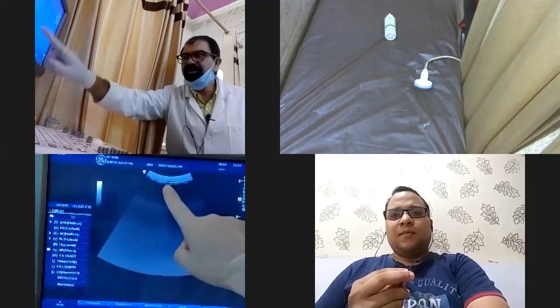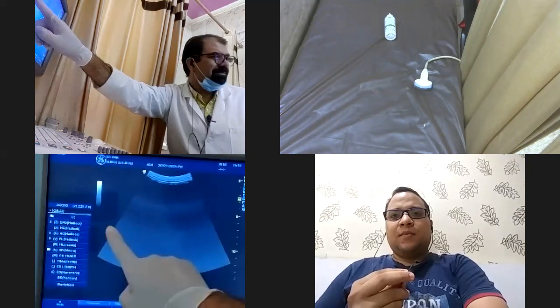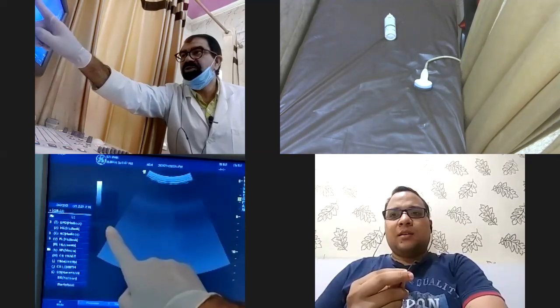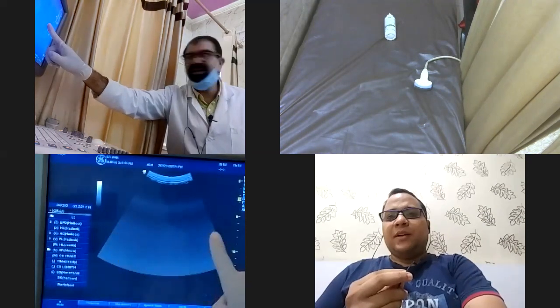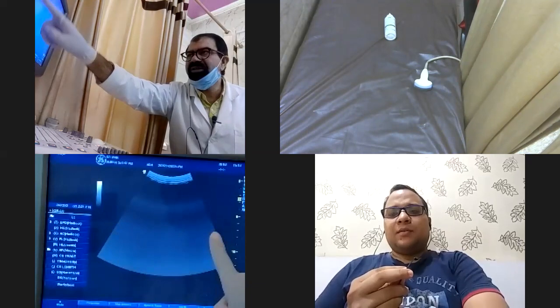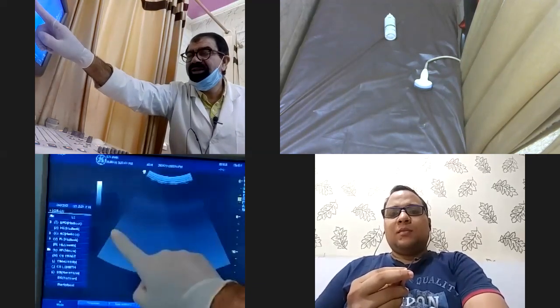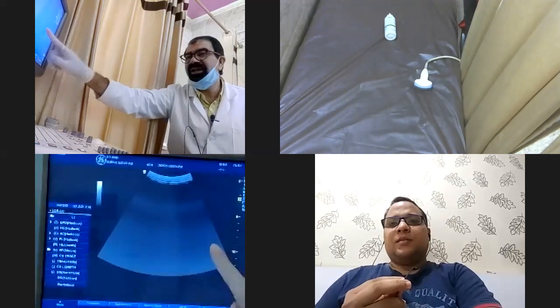Yes. Is this posterior? Yes. Now what is this over here? This is superior, sir. Very good. So this is superior and this is inferior. It means that right is replaced now by superior and left is replaced by inferior.